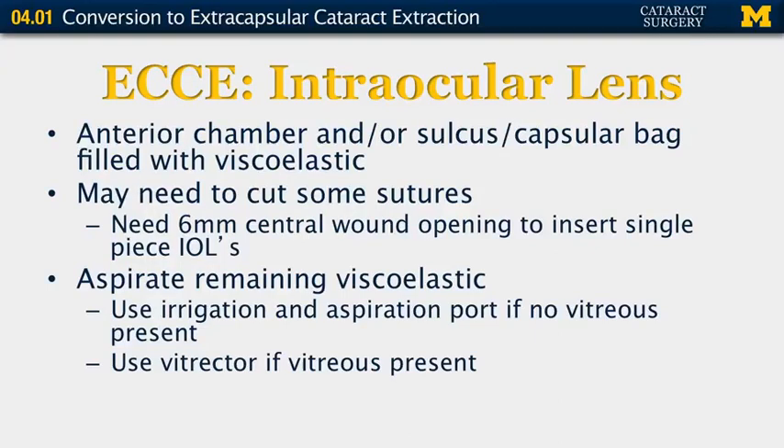At this point, fill your anterior chamber and/or sulcus and capsular bag with viscoelastic to allow for lens insertion. You may need to cut some sutures and measure your opening — you need at least a six-millimeter central opening to insert a single-piece intraocular lens. Once the IOL is placed, remove the remaining viscoelastic with your irrigation and aspiration port if no vitreous is present. If vitreous is present, use the vitrector, which will also cut and prevent issues with vitreous removal.